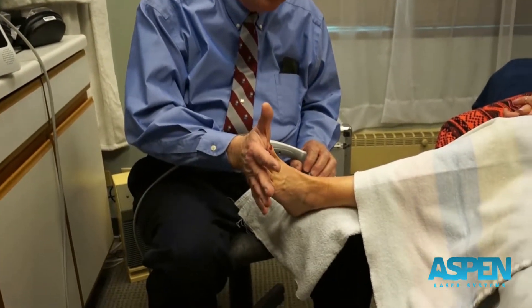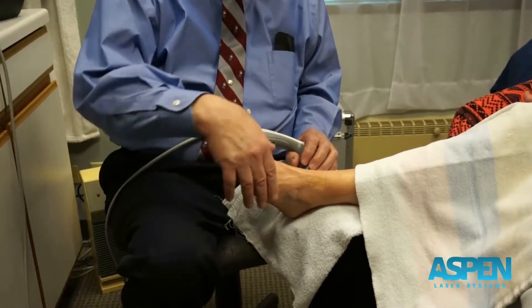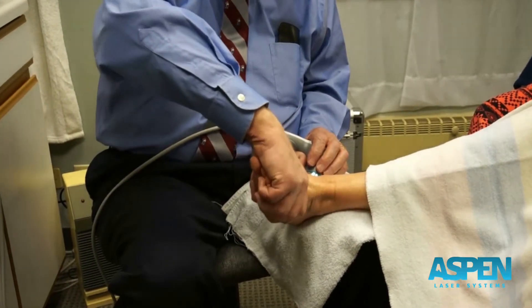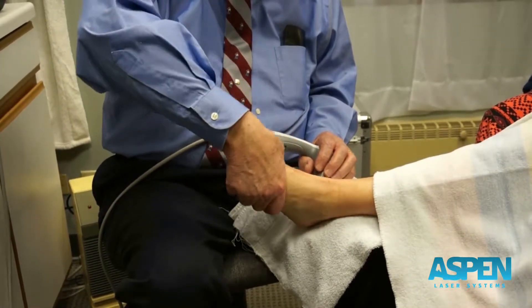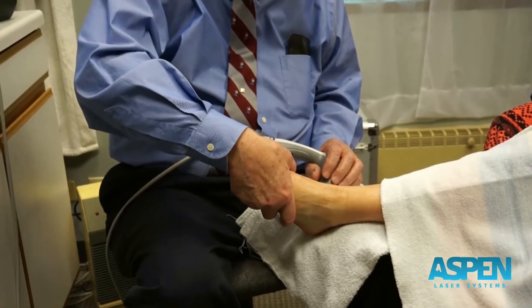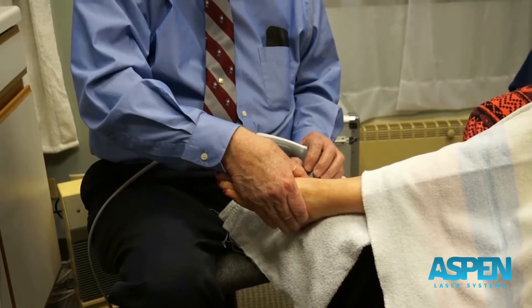One of the things when I'm doing an ankle is have the patient push against my hand, pull up, turn it out, and turn it in, and I do resistance to that. I may do that somewhat while we're doing the therapy too, but I want to isolate also the area of pain.